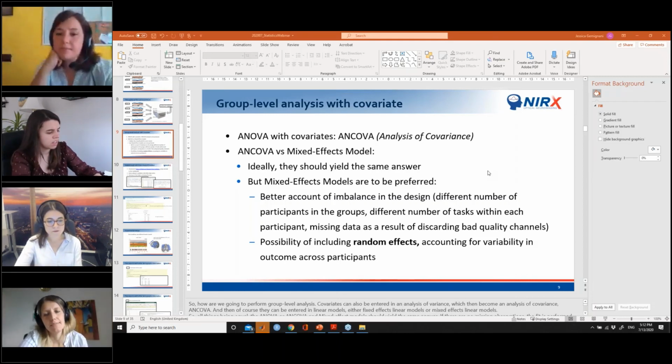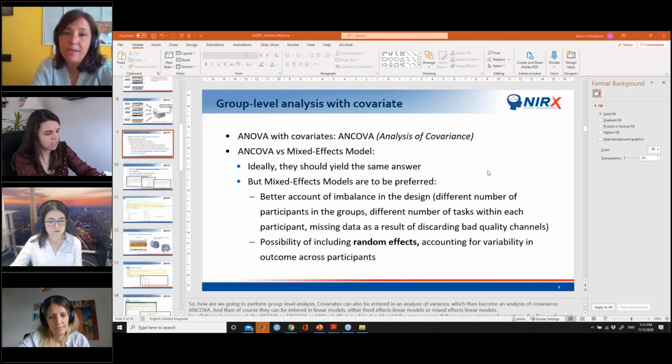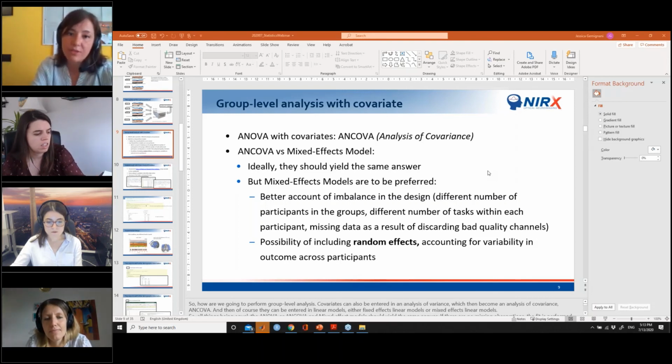This is one of the cases where I was saying that you can add a level of hierarchy in this toolbox, because I would also recommend to keep them separate and add session as an additional factor. In this case, this would be a within subject factor, because if I understand correctly, each subject undergoes 3 different runs. So it's the same subject, it's a repeated measure.